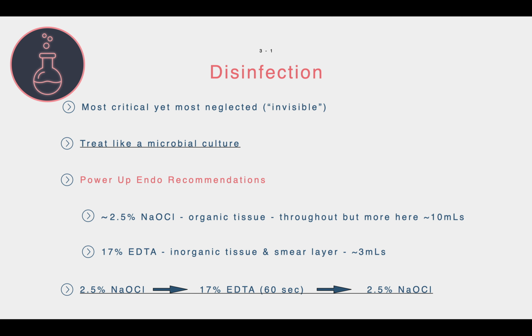I would recommend diluting your sodium hypochlorite 50-50. So you have a half strength sodium hypochlorite. That's super important because you don't want to have any sodium hypochlorite accidents, and that's achieved by squirting your sodium hypochlorite into the periapical tissues. Now, a half strength is going to significantly decrease the chance that you have a sodium hypochlorite accident. I'll discuss that a little more in the complications section of the training program, but keep that in mind.